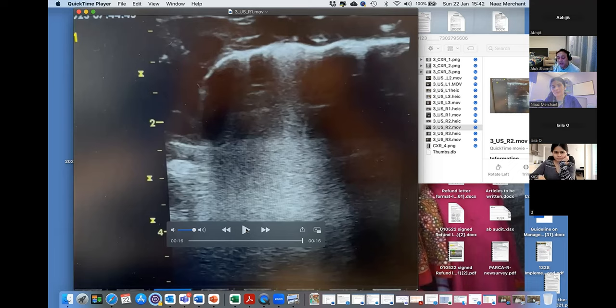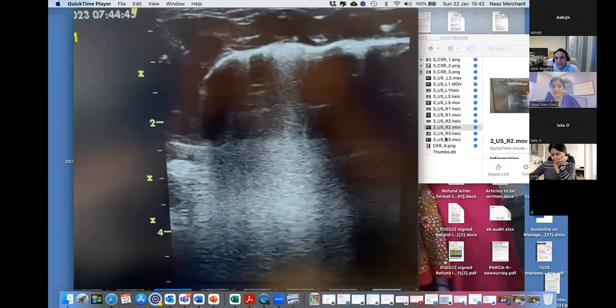My expectation, when I had a look at that first chest X-ray, was to find a complete B whiteout kind of appearance. But what you're giving me here is a very patchy appearance with an upper zone of the lung which has A lines and consolidation. If it has this kind of very mixed distribution, this is very classical for meconium aspiration. No shred sign, no irregularities of the pleura, goes against a lobar kind of presentation.